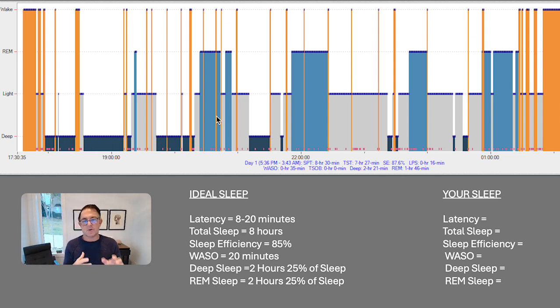So the actual structure of this is that the first 4 hours of your sleep should primarily be deep sleep. And you can see for this person that a lot of the first half of this is dark blue deep sleep. And that's because your first purpose of sleep is to build back the body as quick as possible. And deep sleep does that. Builds back the large organs, works on different hormones in your body. And usually within about 4 hours, the body is ready to go.